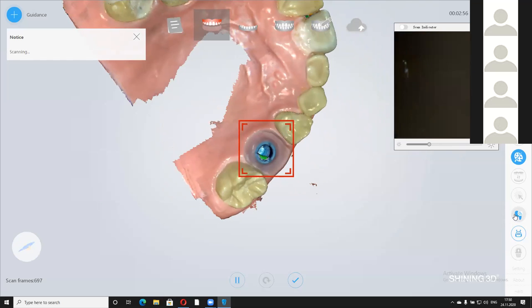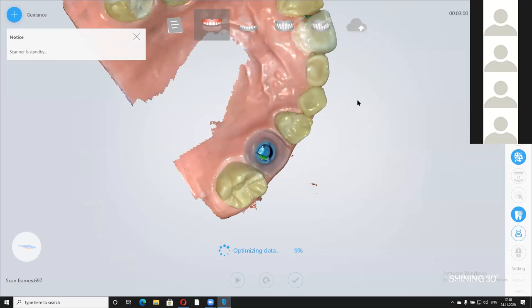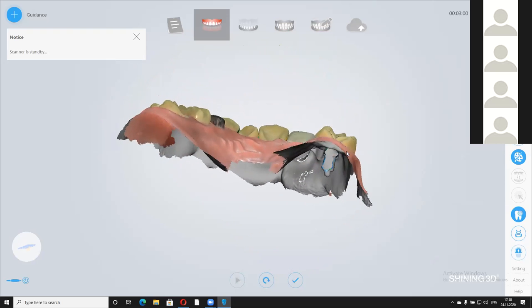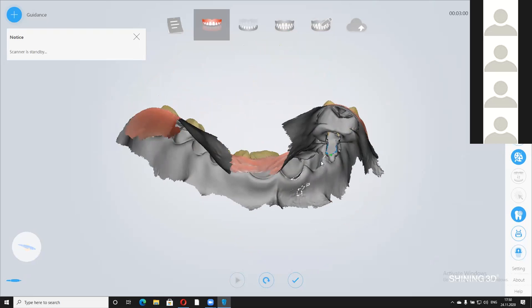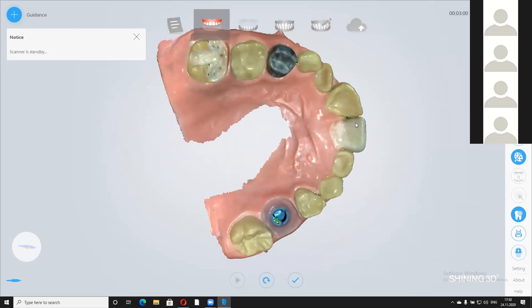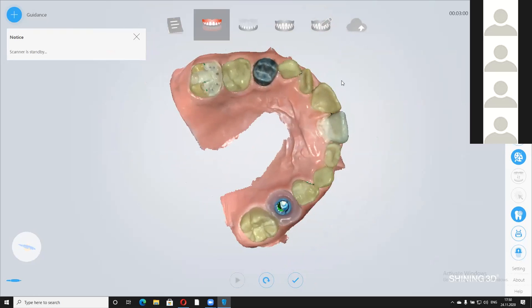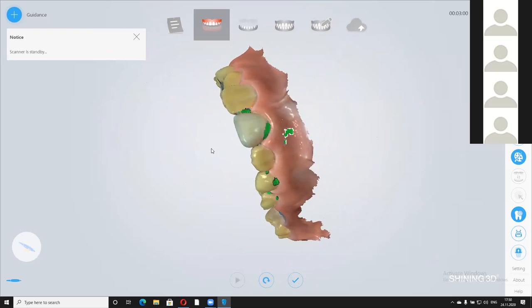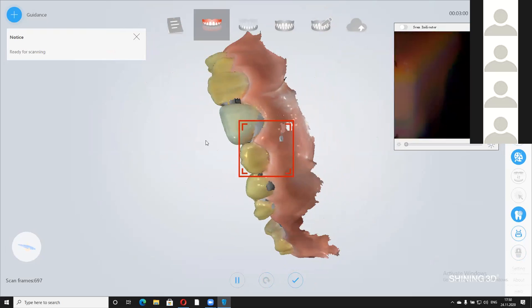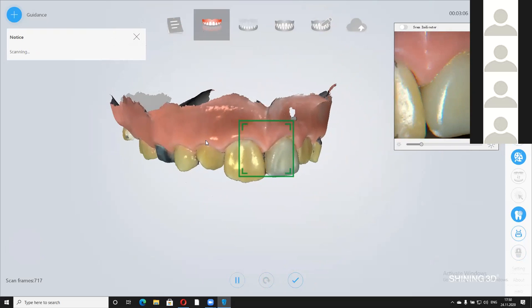Now, I'll put the camera down for a second. And let's look from underneath. And you see how fast the optimization of data has happened, really fast. And you can see from down here, it scanned the whole implant, okay, downwards. Very, very amazing. Now, if you have small holes, like you see here, maybe you can just go over the scan and scan those areas. I won't really bother now, you know, like here, here, let's do this a little bit better. So I pick up the scanner again. I go to this area. And then I just scan it.